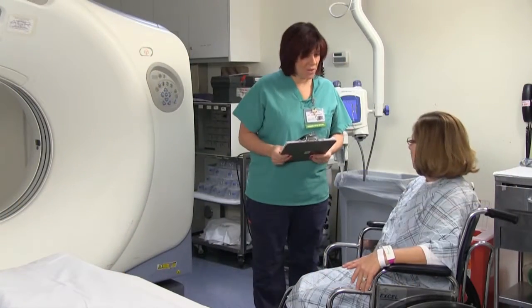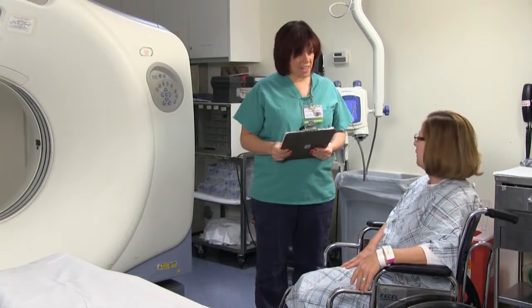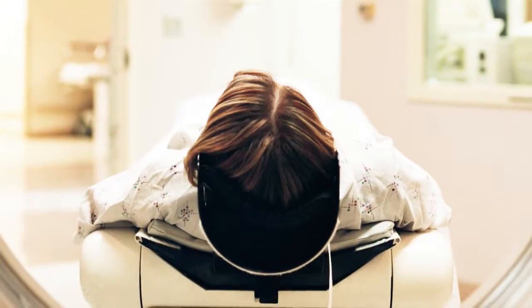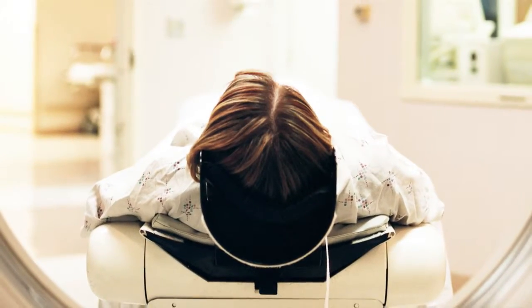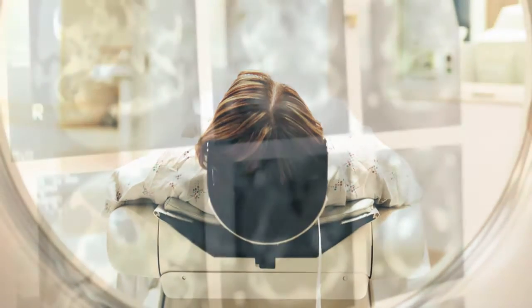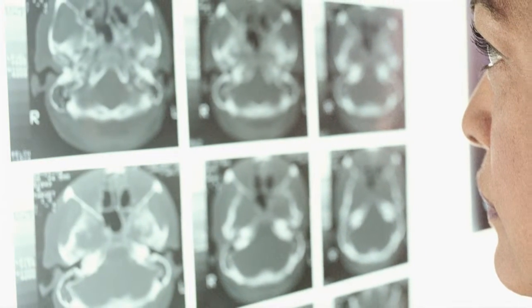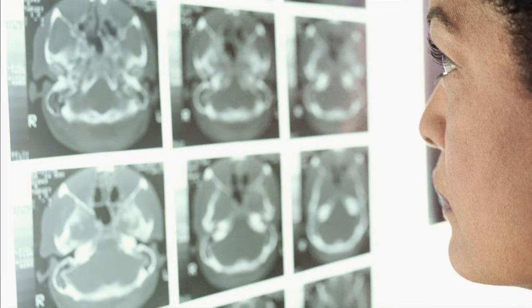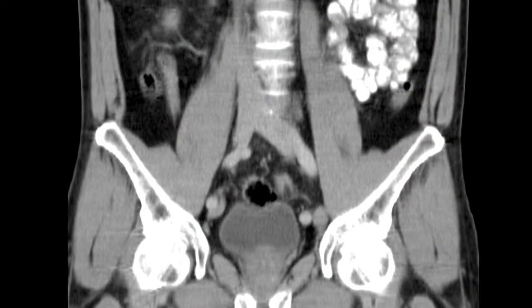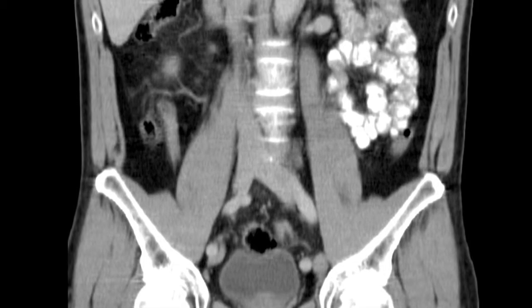In the next few minutes, we're going to answer all of those questions and a few more that may not have even crossed your mind yet. Let's begin by describing what a CT scan is. Simply put, it is a procedure that takes several x-rays. It uses a computer to combine those x-rays into cross-sectional views — that is, three-dimensional images — of your internal organs and body parts.